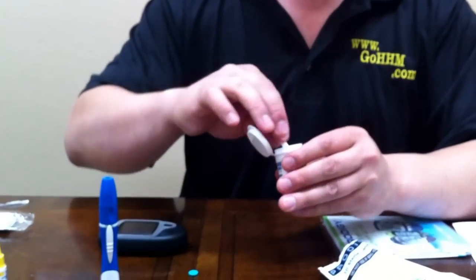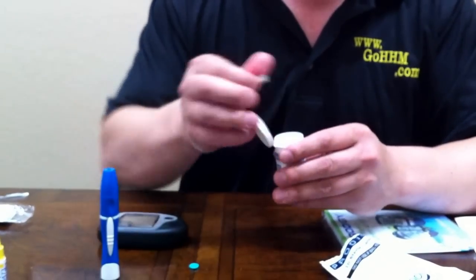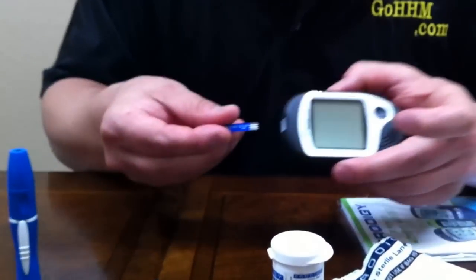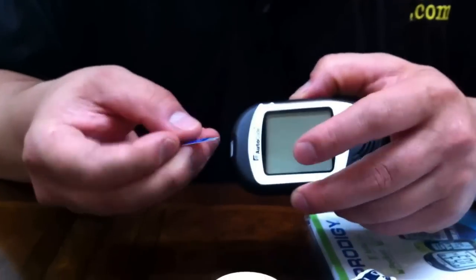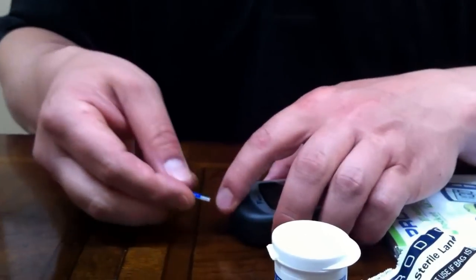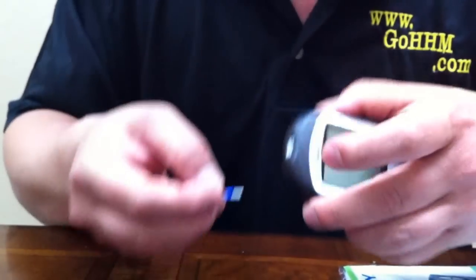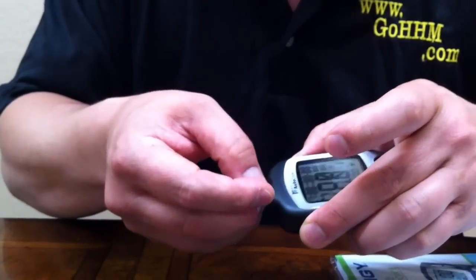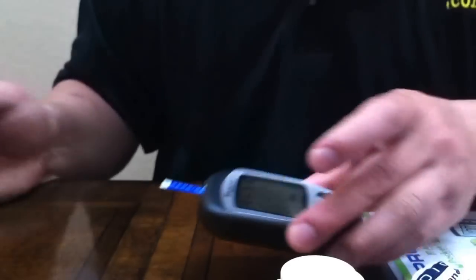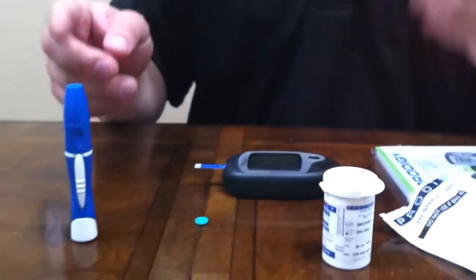Now, to turn your brand new Prodigy AutoCode meter on, we're going to take our strip with the little chip side up. For the visually impaired, you'll feel the little bump there. Then you're going to put that in right here on the front of the machine. Your Prodigy meter is on — please wait. Please apply blood into the test strip.